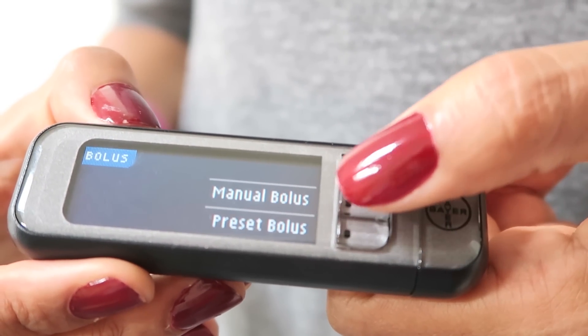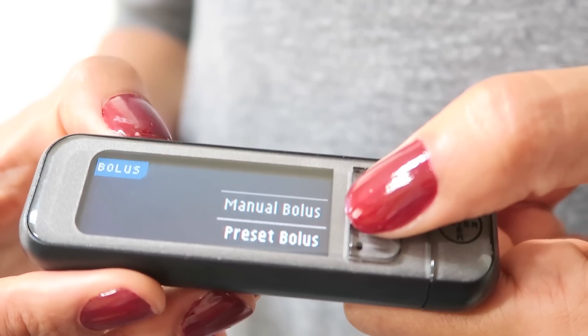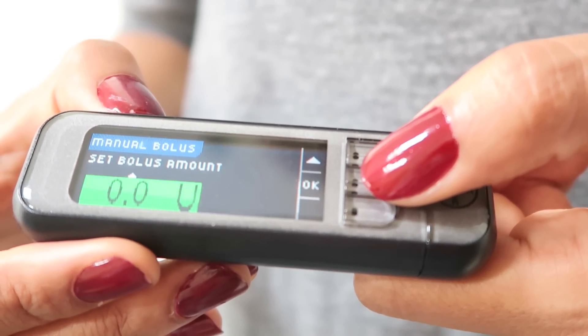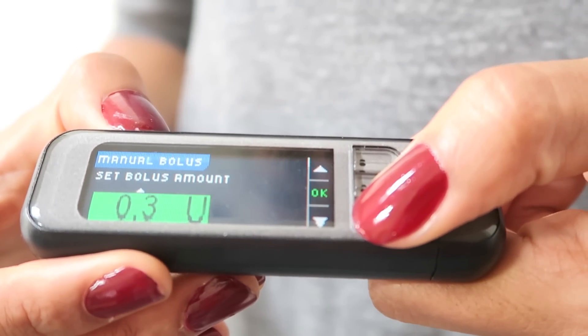If I want to do a bolus, I just click bolus. I can do a manual bolus — I click here, it connects to the pump, I dial in the units and tell it what I want to do, and then the pump vibrates to tell me that it's connected, that it's heard me, and that it's delivering the insulin, which is fantastic.